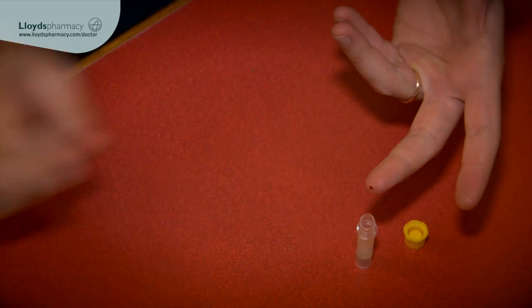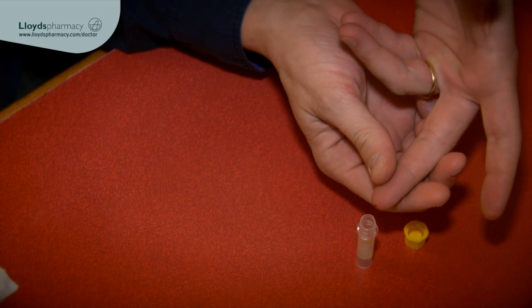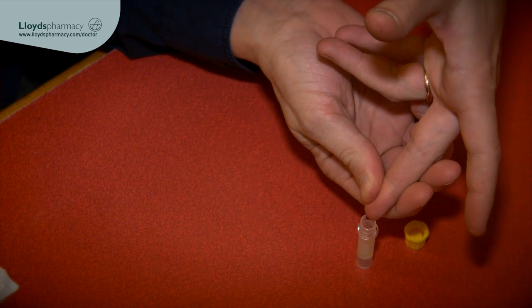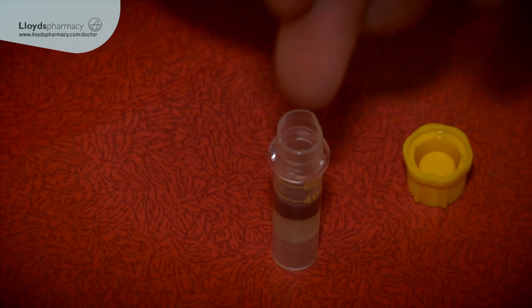Now as you can see you just wipe away the first bit of blood with a tissue and then you drip it into the bottle. And you've just got to milk the finger so that the blood comes out. So I filled the bottle up to the top marker. It wasn't actually that bad at all.